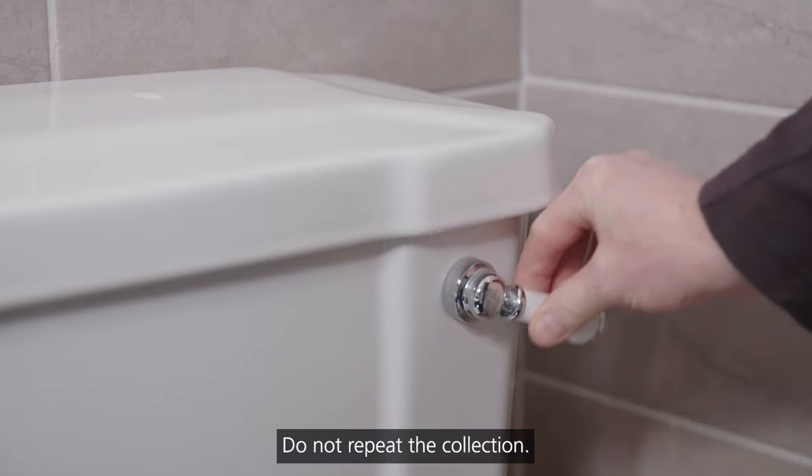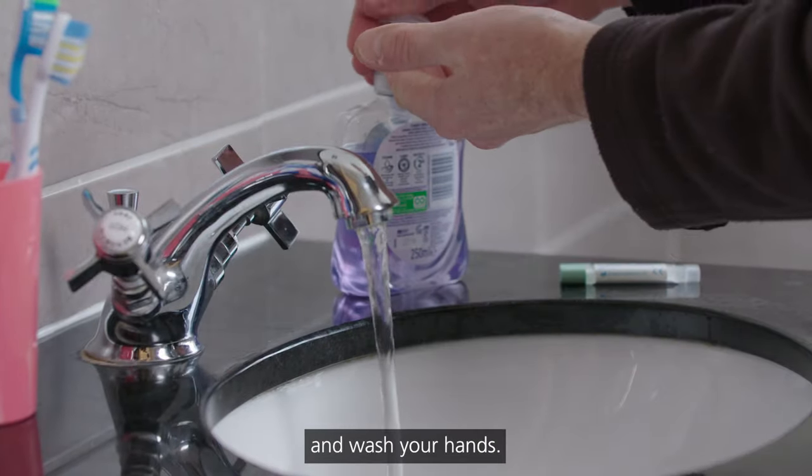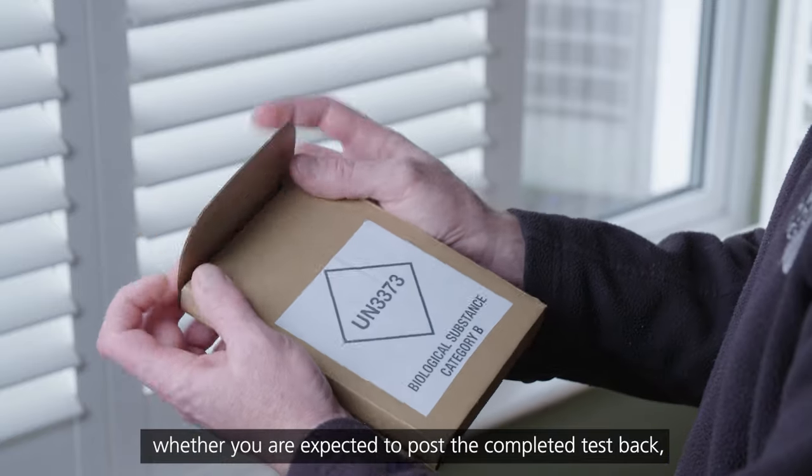Do not repeat the collection. Flush the toilet paper and leftover poo, and wash your hands.